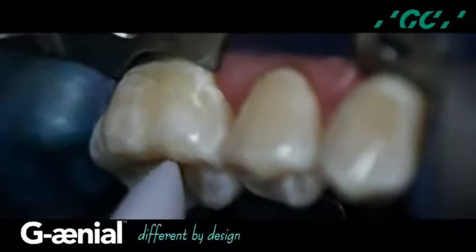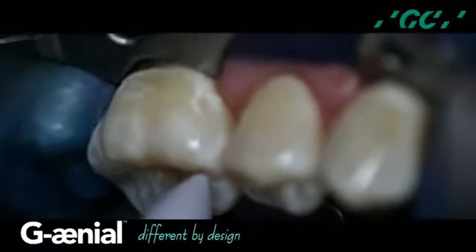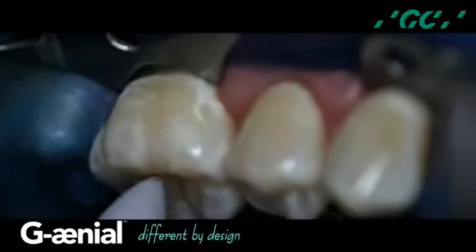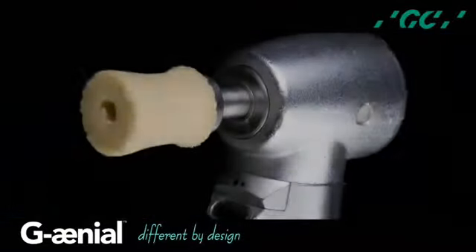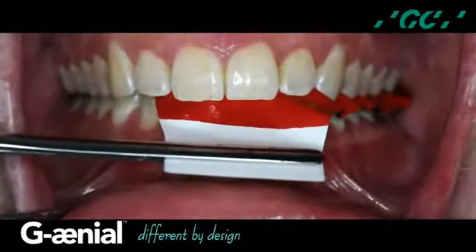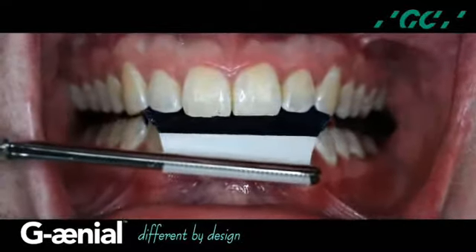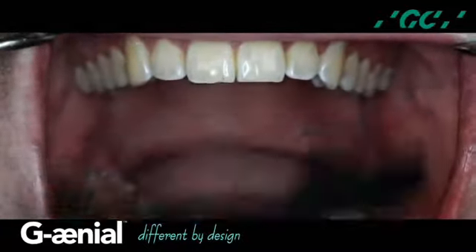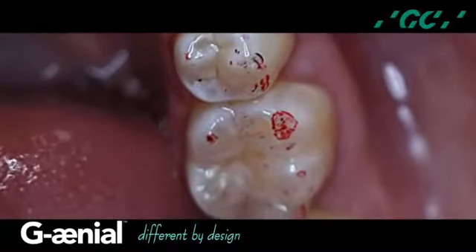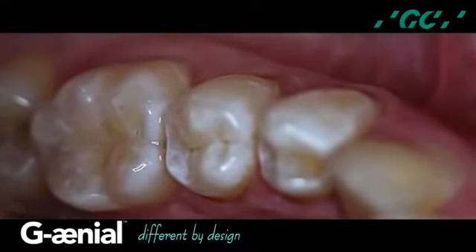A silicone point, an ET Illustra polisher, is used to give a high surface reflectivity while maintaining the precisely developed anatomical contours. An enhanced foam cup with loose abrasive diamond paste is used to create a high luster. The occlusion is inspected with the patient in an upright position in centric occlusion and inspected for any prematurities, protrusive and lateral excursions, and the restoration is inspected for prematurities. And the completed restoration displaying function with an optimal integration of anatomical form and color.